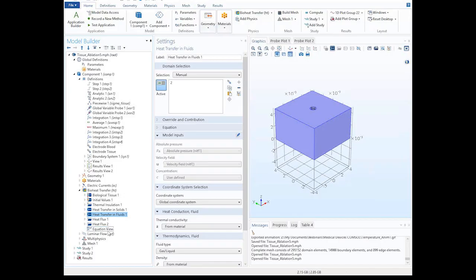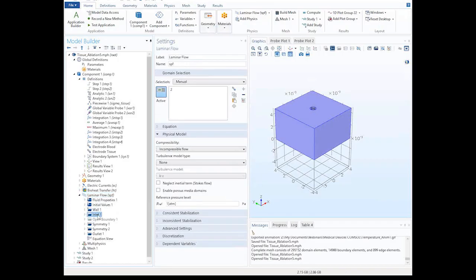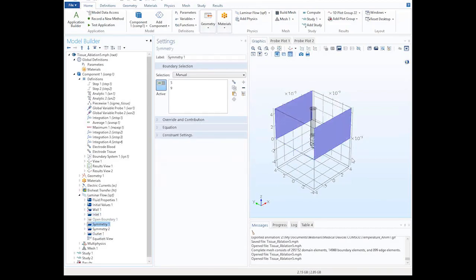I'll minimize that. Laminar flow is only applied to this part. I just put simple boundary conditions like inlet at this end, outlet at this end, and I put symmetry here. Again, something can be done more accurately, but for the purpose of illustration, that's good enough.